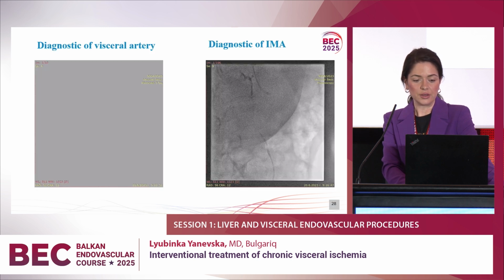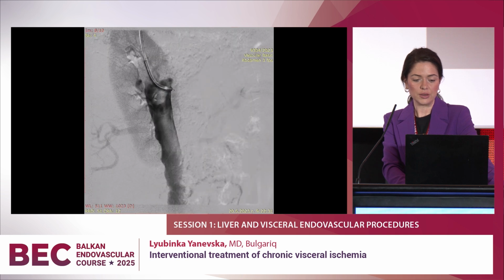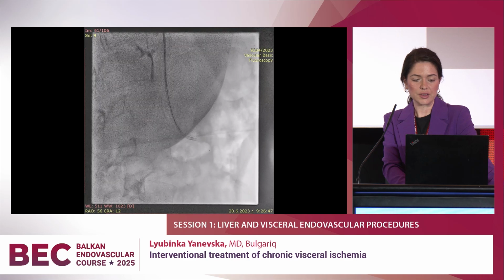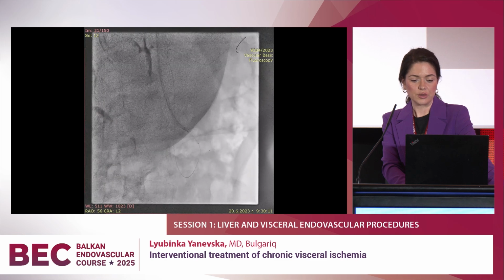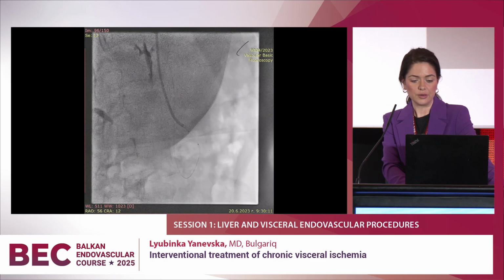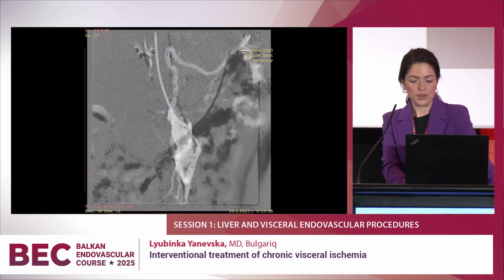This is a visceral artery diagnostic with pathology and diagnostic of the inferior mesenteric artery, with predilatation in the inferior mesenteric artery in this slide. Stent implantation, Hercules stent.